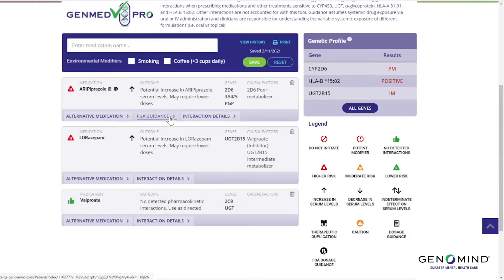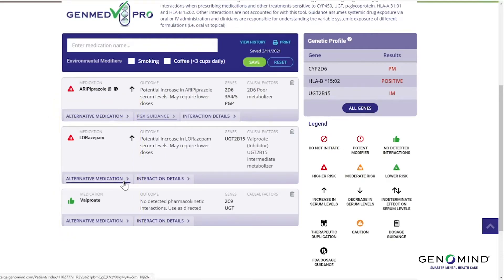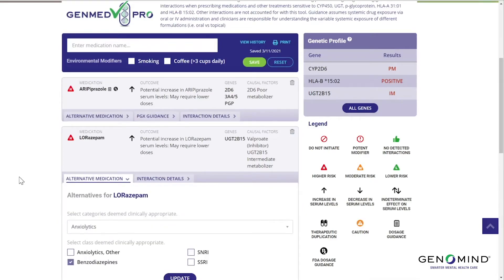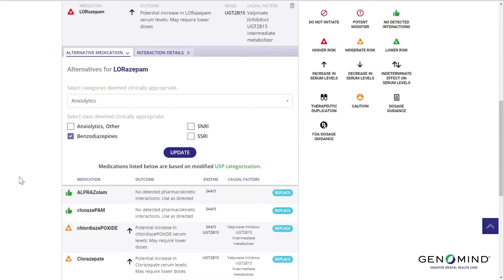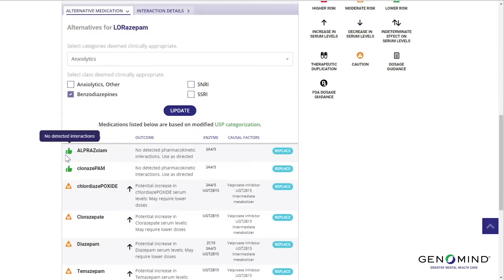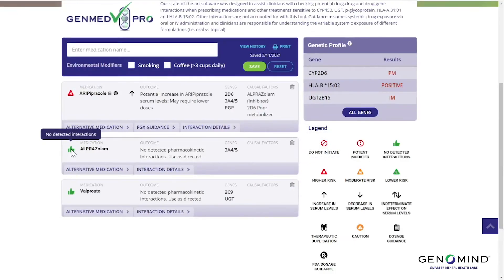While it's great to understand these complex interactions, we also want to have some guidance on alternatives that may present a less risky interaction. Our alternative medications tab will generate a list of related medications ranked by their risk of pharmacokinetic interactions. Using lorazepam as an example, we can see that alprazolam or clonazepam are two benzodiazepines with a cleaner drug-drug, drug-gene interaction profile. You can select the replace button if you want to add this medication to the current drug list. Of course, other patient factors should always be taken into account since GenMedPro only assesses CYP450, UGT, and P-glycoprotein interactions.